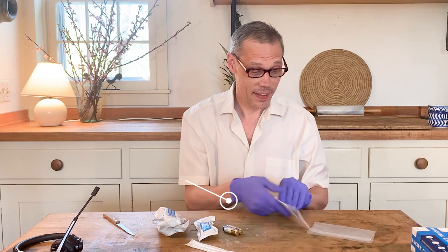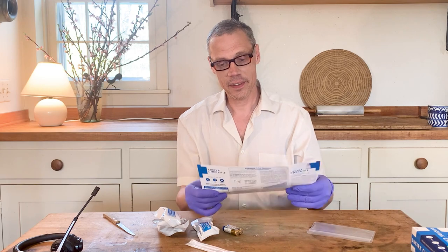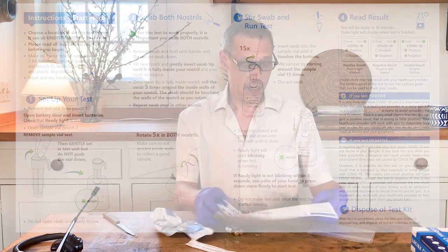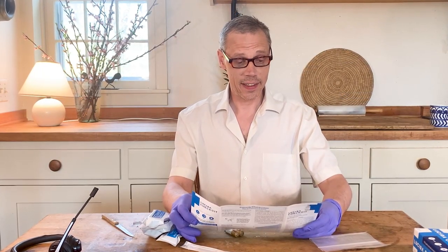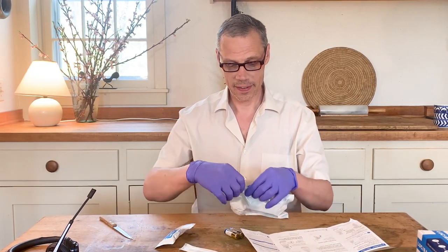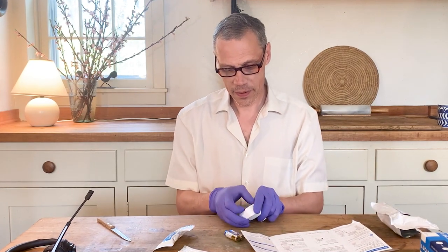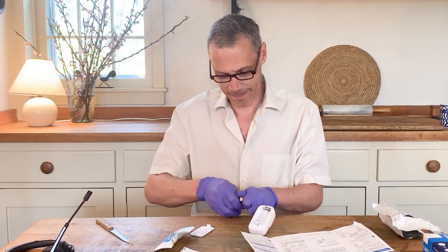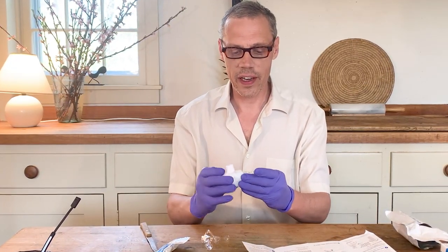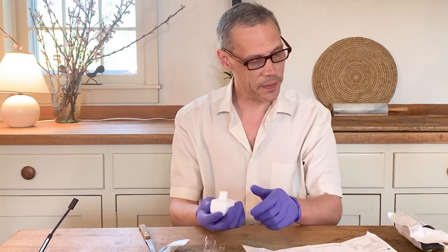Here are the directions — just four steps according to this. Number one: set up the test. Open the battery door and insert the batteries. You can see this device has a kind of a little ready light that's on. This is some kind of base station for the test.